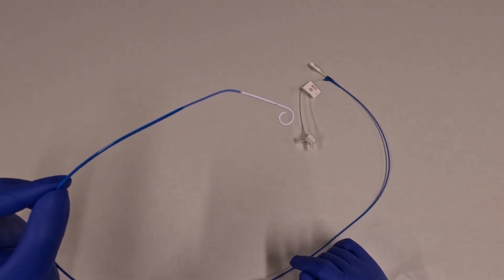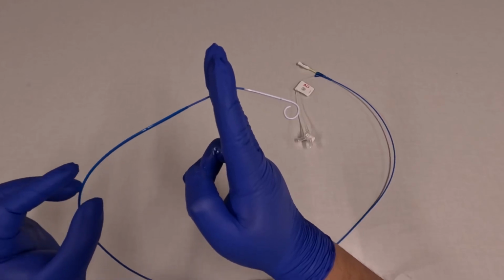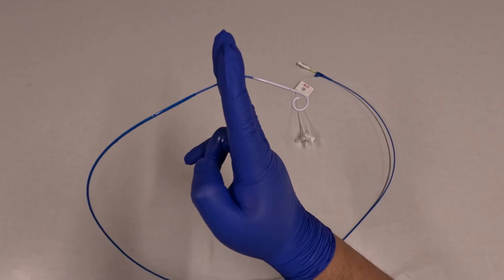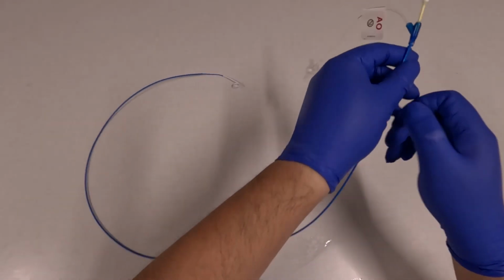When you're prepping the catheter, you flush both lumens at the end, and when you insert the catheter, the bent portion should be across the location of the gradient, so across the aortic valve if that's what you're measuring.